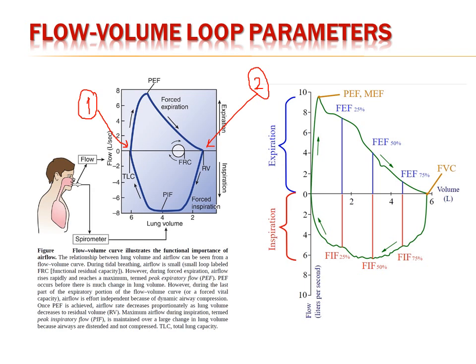The patient will start the exhalation as fast as he can, and this will be shown in the upper part of the curve, because the upper part represents the expiration period. As you can see, first the air will flow out very fast from the mouth of the patient.